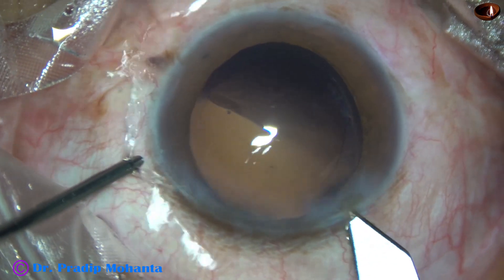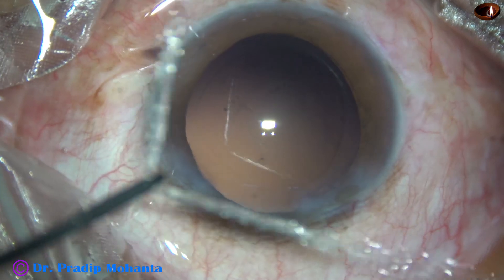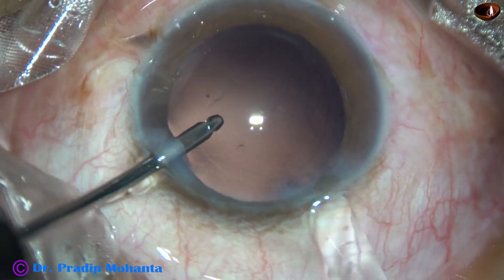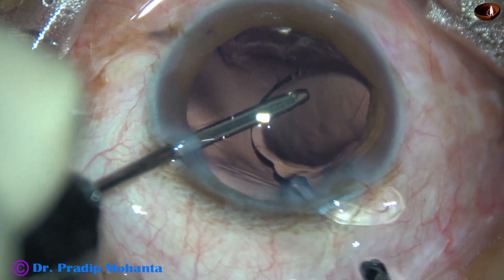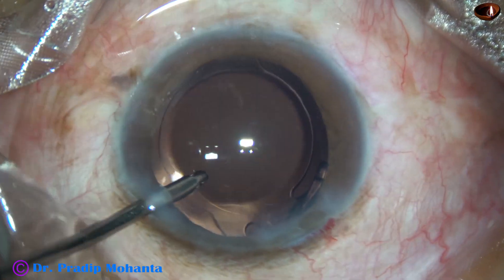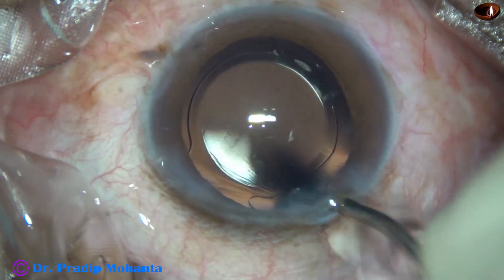The main wound is enlarged a little bit and then hydroimplantation of a single piece monofocal intraocular lens is done. By a tap of the left-hand instrument, the intraocular lens goes into the capsular bag.